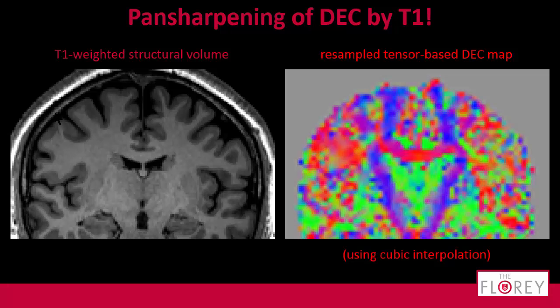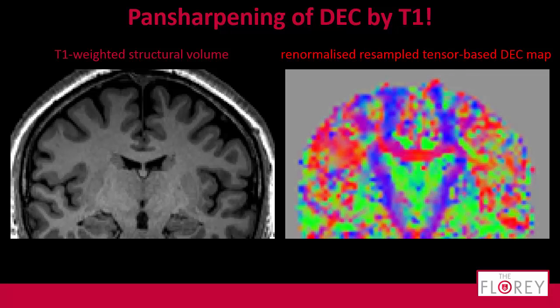And because of this, the norms of my DEC vectors can go a bit up and down. You might be able to see this. I don't know how clear it is, but you see some weird dark boundaries and sometimes something that is a bit brighter there. Well, if I normalize them again, you get this. This should be a little bit smoother if it works out on the projector.